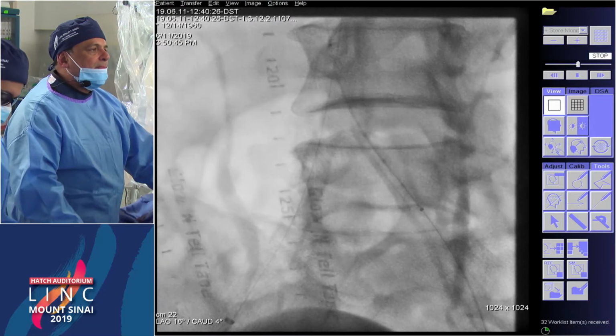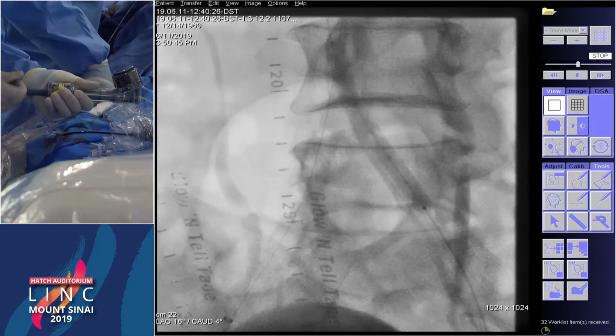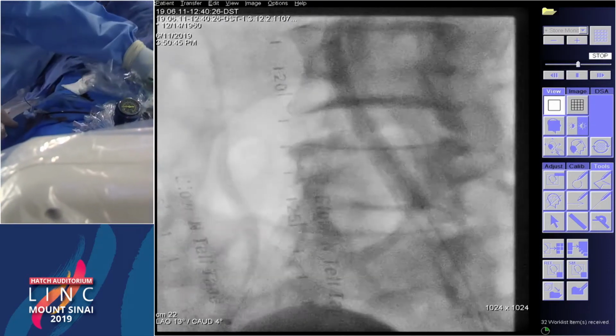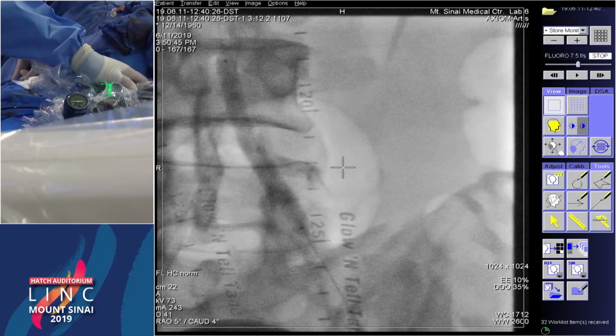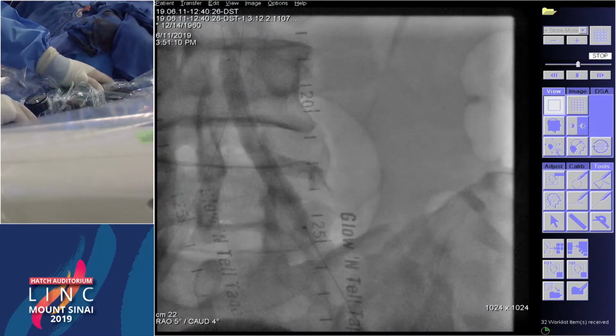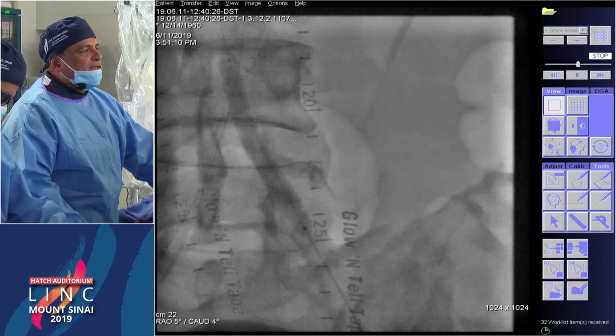Then I came in with a Shockwave, just a 7mm balloon, which is smaller than what you need. But just doing that, then suddenly I was able to get that 24 French dry seal up without any trouble at all. So it is pretty impressive what you're able to do when you're changing really the calcific nature of these plaques. And Jim, what I did here in Anbar is I put up the shockwave balloon into the aorta.